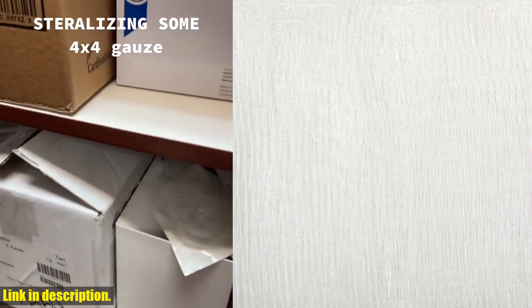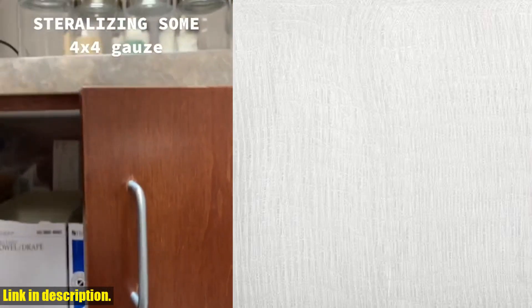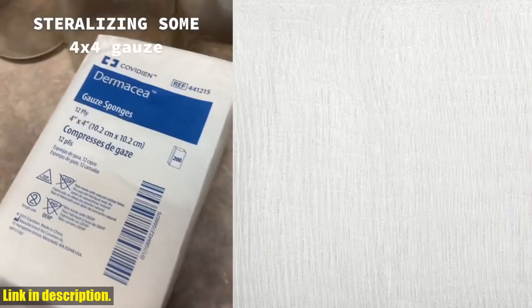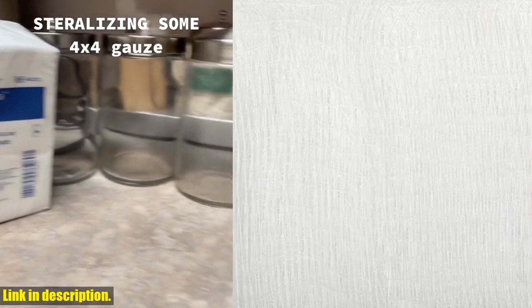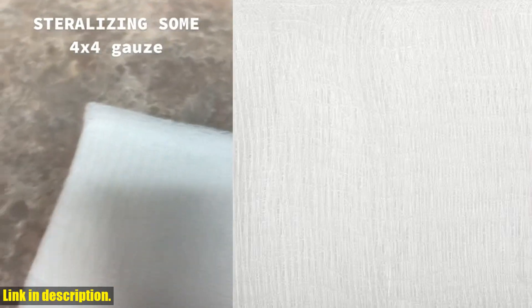In each pack, you'll get 200 of these incredible gauze sponges, which means you'll be stocked up and ready to handle any wound care situation that comes your way. Whether it's for wound dressings, wound packing, or general wound care, Medline gauze sponges are the perfect addition to any first aid kit.